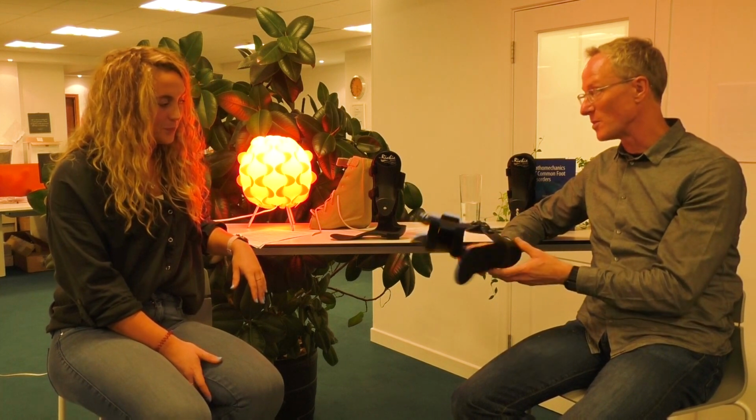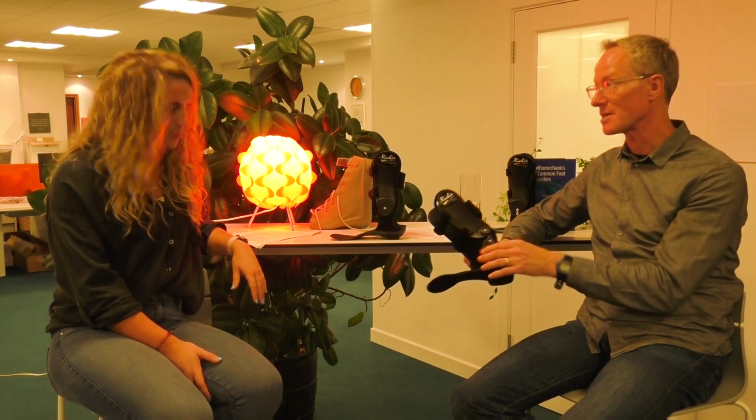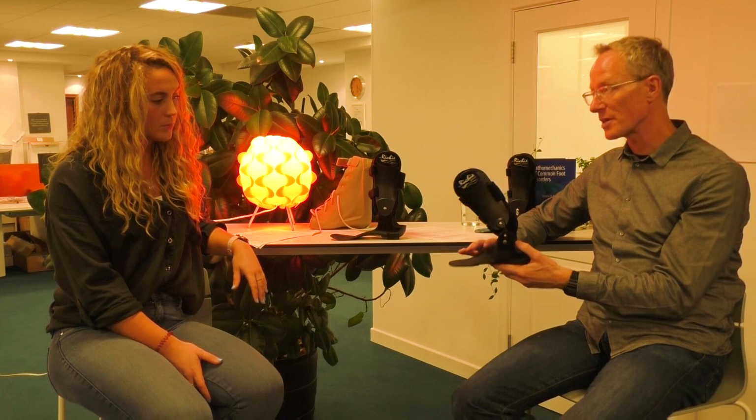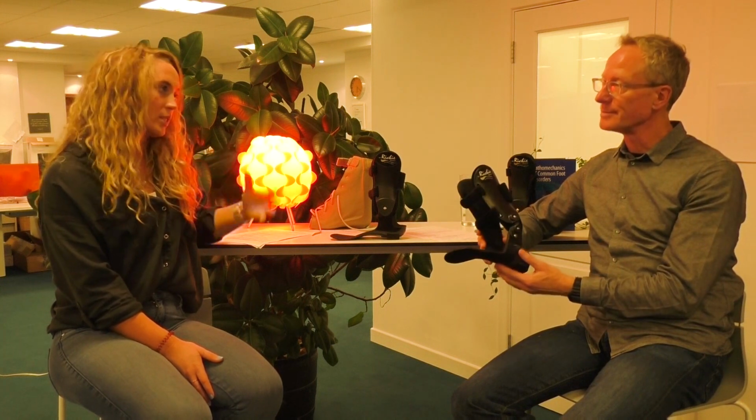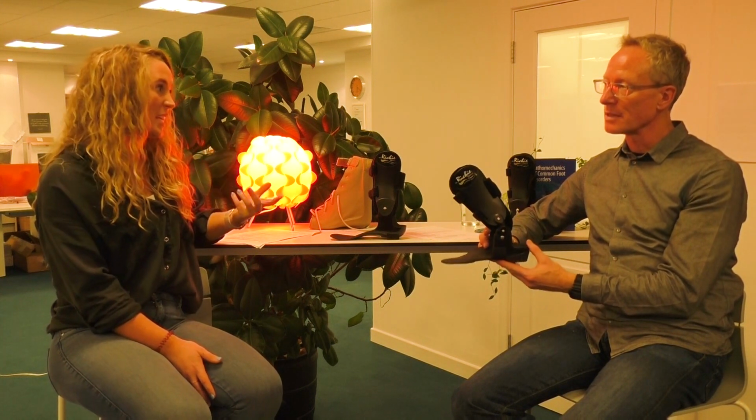Yes, yeah. The most common brace, I suppose, for foot drop is the dynamic assist Tamarack hinge, and this is really for the flaccid foot drop. So you can correct that foot, put it in the correct position, you can bring the foot to 90 degrees at the ankle, and there is some pathology that is creating this flaccid foot drop, which affects the person in the swing phase. Yeah, and they still have some active dorsiflexion or eversion. That's really key in this.